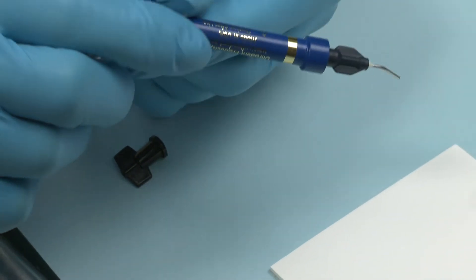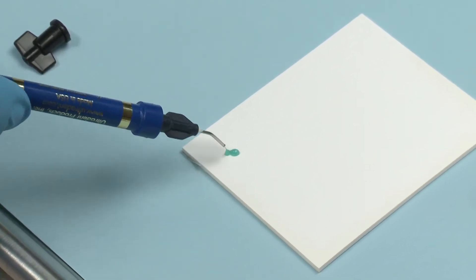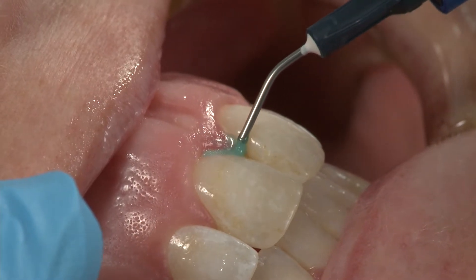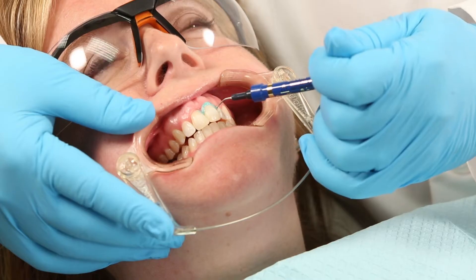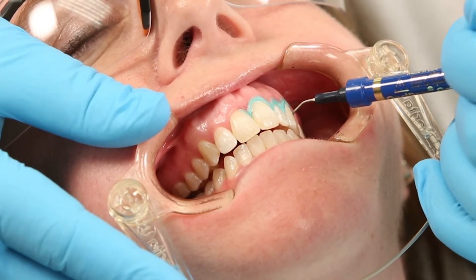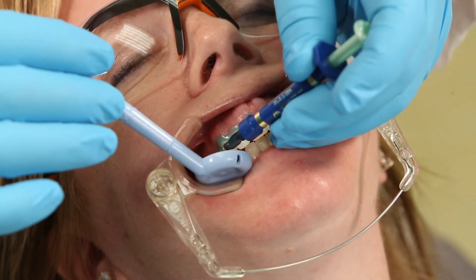Alternatively, a light-cured resin barrier such as Opal Dam can also be placed at the gingival margin prior to the procedure to prevent tissue damage. When using Opal Dam, express the resin to build a 2 mm strip along the gingival margins, extending about 0.5 mm onto the enamel. Extend the resin beyond the last tooth to be treated.